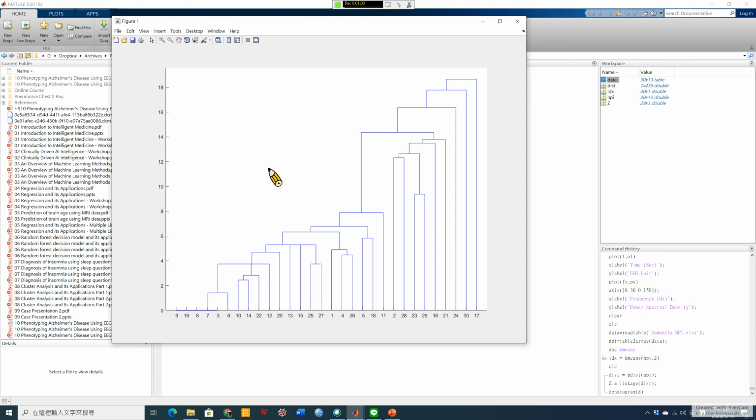That is totally dependent on how you define the distance or similarity. You remember last week I showed you that we already published a unique method called the information-based similarity index, and we can apply that distance metric to different kinds of symbolic data.